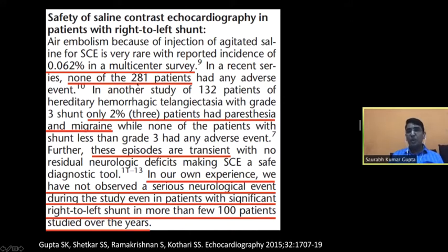And as you can see, multiple studies, multicentric, with a very large number of patients, including a large number of patients with definitive pulmonary AVM in relation to hereditary hemorrhagic telangiectasia, have shown that saline contrast echocardiography is safe. And these episodes, sometimes if they happen, are also transient, and there are no reports where permanent damage or neurological deficit has happened to any patient who has undergone saline contrast echocardiography.